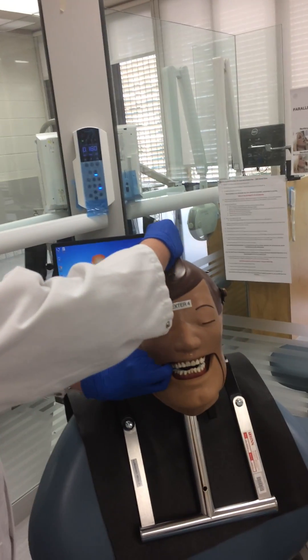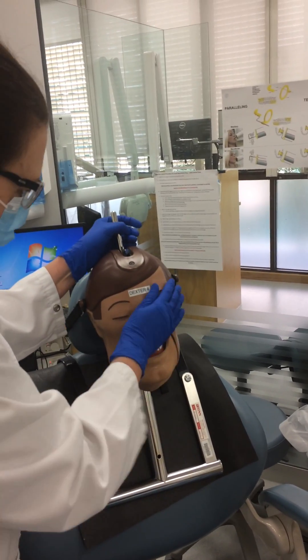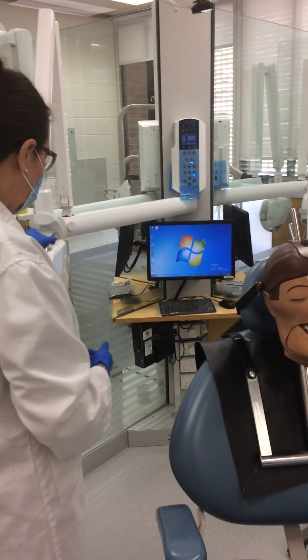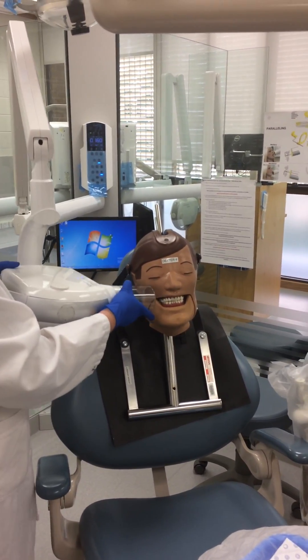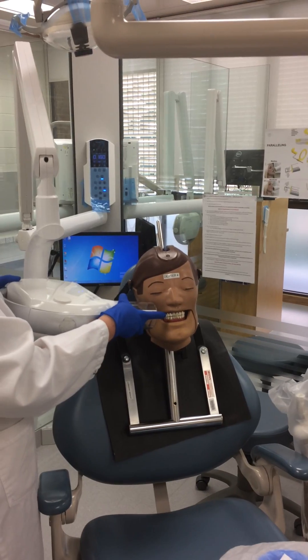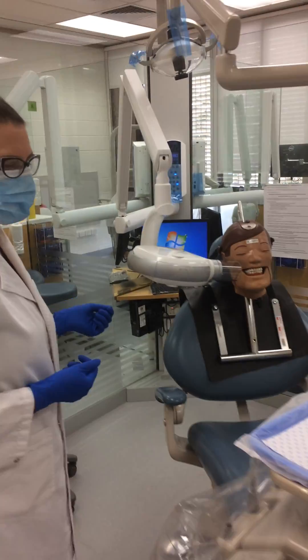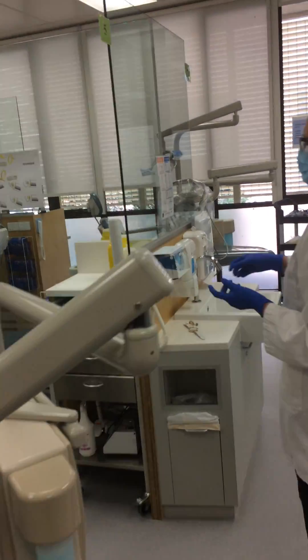You then close the mouth and make sure the patient is biting nice and firmly. You then bring your PID, align the phosphor plate in what you consider to be the correct position, and then you move away and move over to your exposure button.